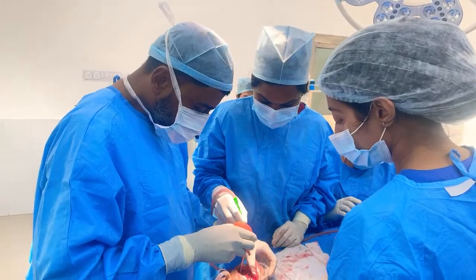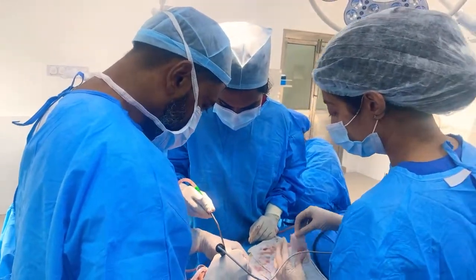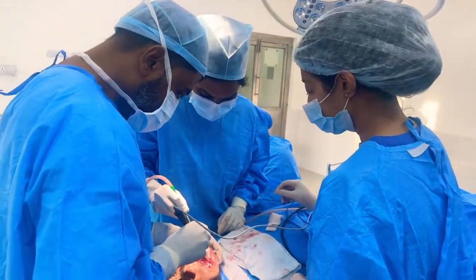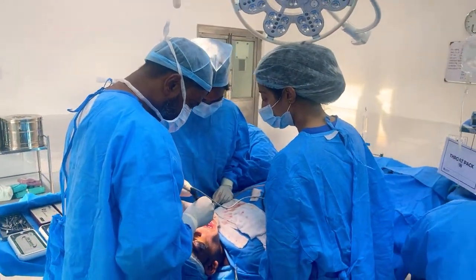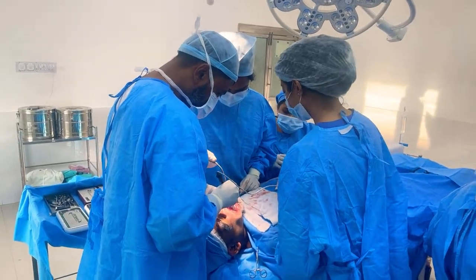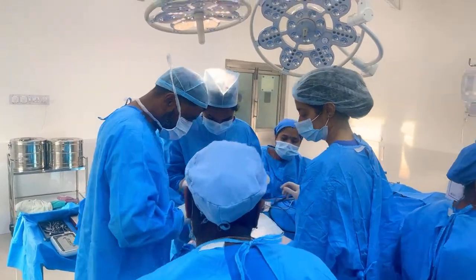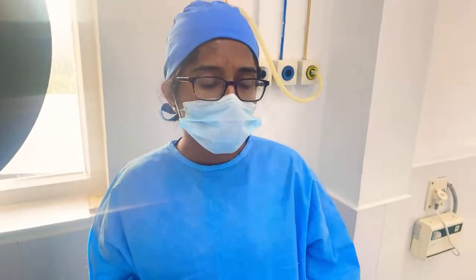Now we are going to use some cauterization as in controlling the bleeding, and once we ensure a clear field, that's when we are going to start doing our fixation.